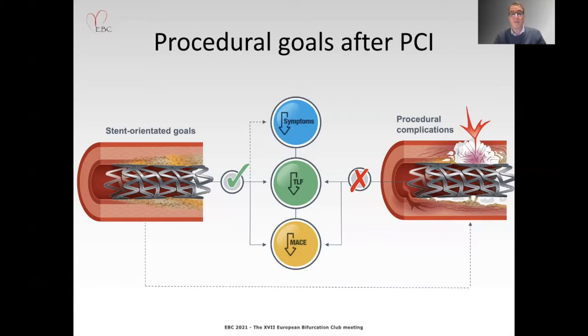Balloons have an insufficient force to crack calcium, often resulting in barotrauma or balloon rupture. Also, atheroablative strategies are limited by wire bias, potentially resulting in slow flow situations or even perforation.